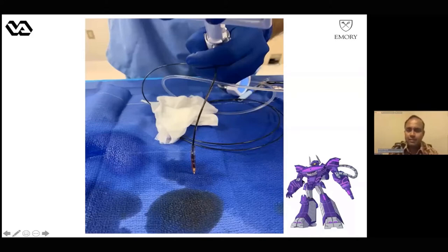But yes, it could be due to hydraulic dissection behind the stent, or it could be fracturing of the media resulting in blood, or in this case, contrast being able to extrude through the media behind the stent. Because for example, in this patient, he actually has stent in most of the proximal RCA except the ostium. And we will study this shortly.